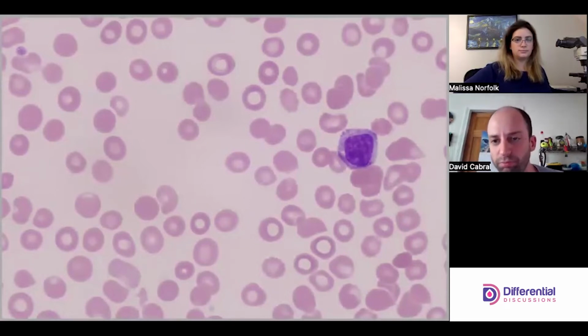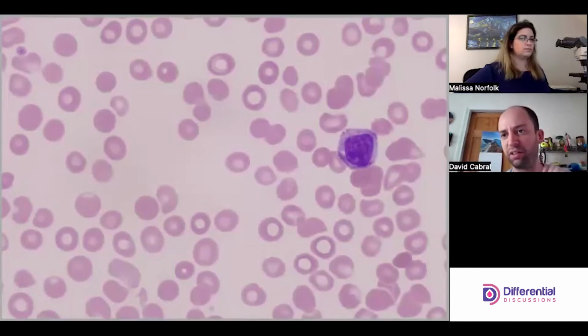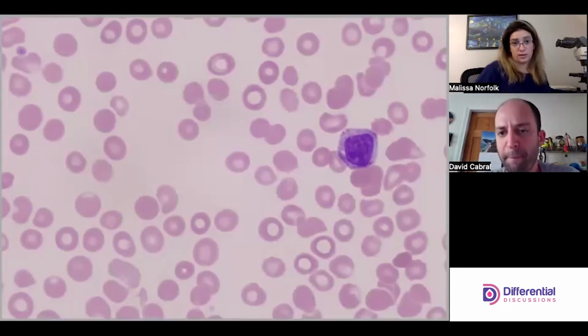So you'll have to help me with the granules here, but talking about the nucleus, it looks more clumped and mature. Some of the granules look like they might be kind of large to me. And so I might think about some kind of an immature baso kind of thing. But not that large yet. Okay, so this just looks like a myelo. Yeah. And some of our myelos had those weird kind of granules in them, right? So baso granules will be larger, even at the myelo stage.